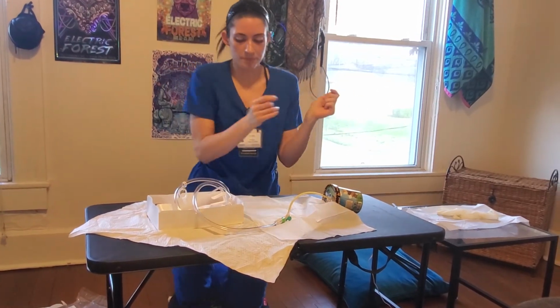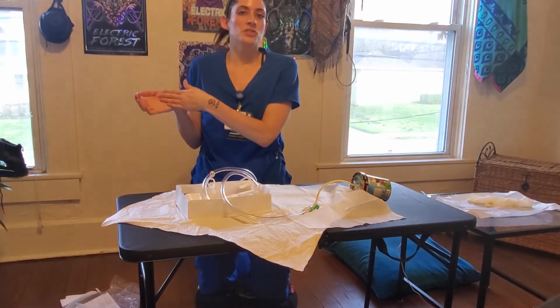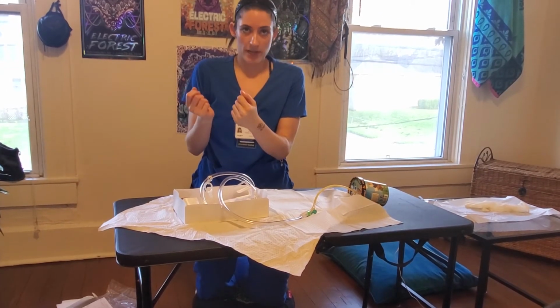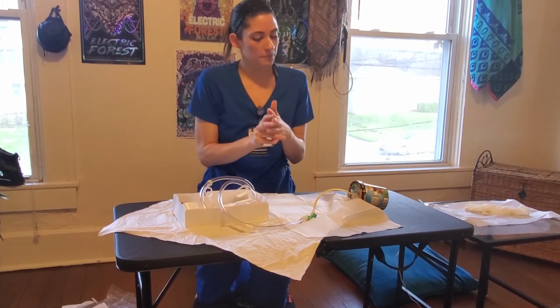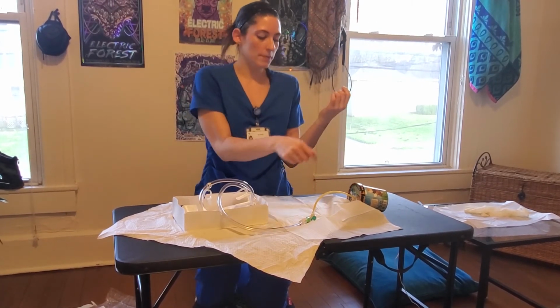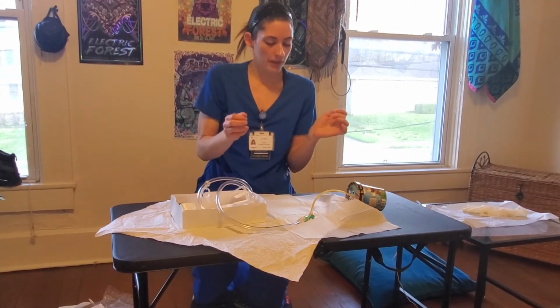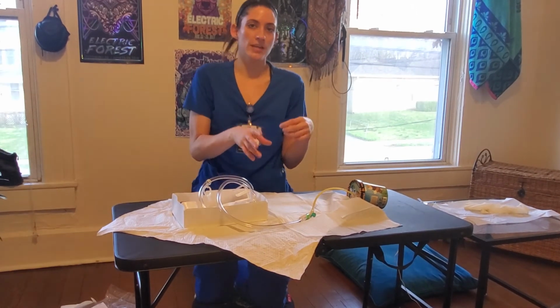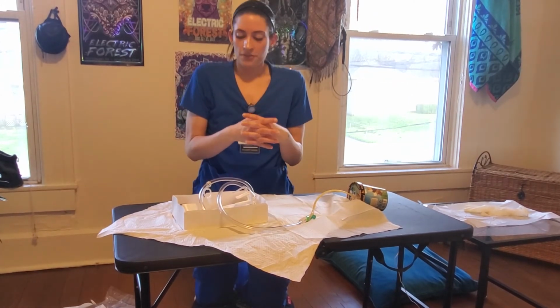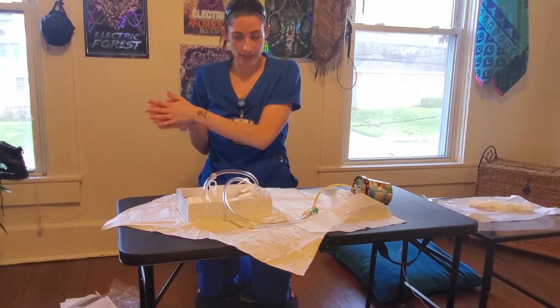Dispose of them. I'm going to wash my hands again. And I'm going to don non-sterile gloves because I need to do perianal care one more time. I'll just be verbalizing this one. We would clean in the same procedure, farther side of the labia and the closer side of the labia, and then the center, and we would clean down the catheter a few inches as well. We especially want to do this because it's going to remove irritating agents like the betadine or the lubricant if they were left on. Okay, so now we want to remove my gloves and wash my hands again.